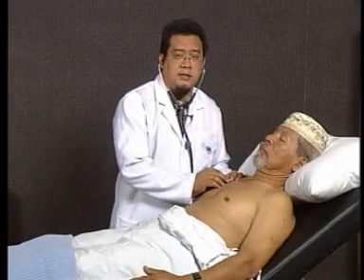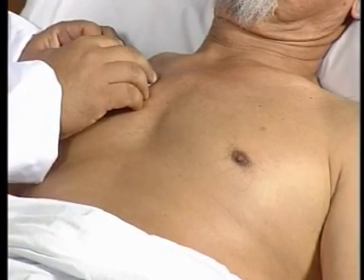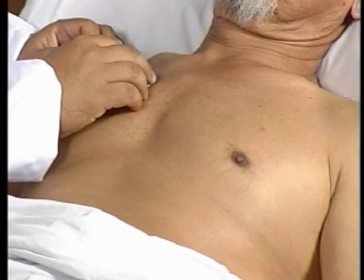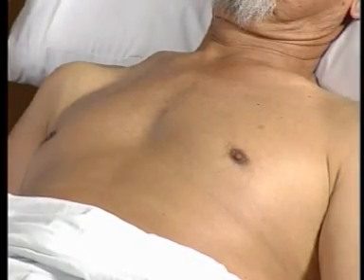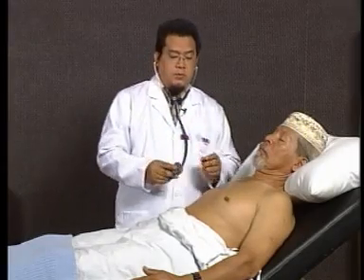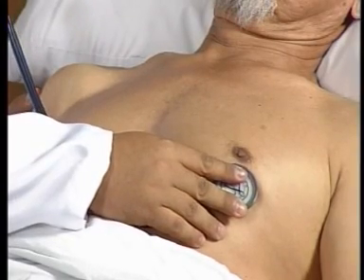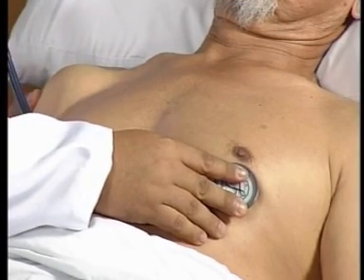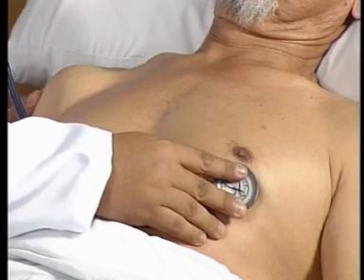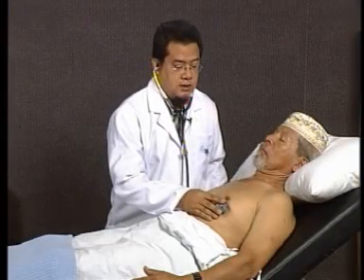The next area to auscultate is the aortic area. And we are now looking for any added sounds. We then turn our stethoscope from the diaphragm to the bell to listen for low-pitched sounds. We go back to the area of the apex. We will now concentrate on whether there is presence of a mid-diastolic murmur, which is usually difficult to hear unless we use our bell.